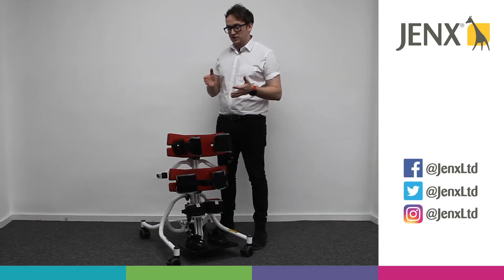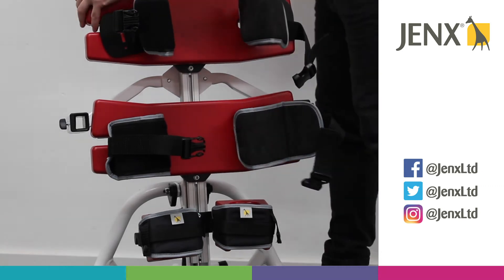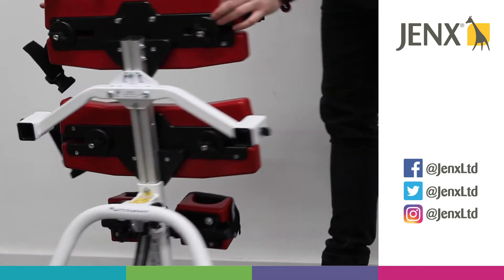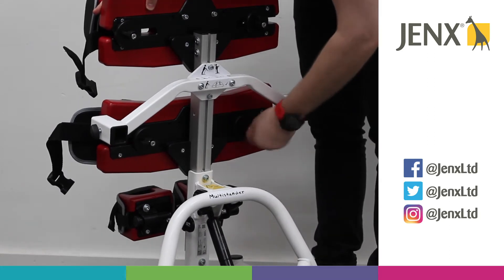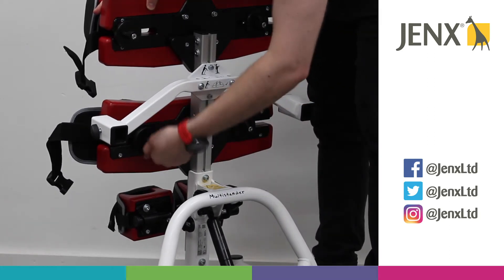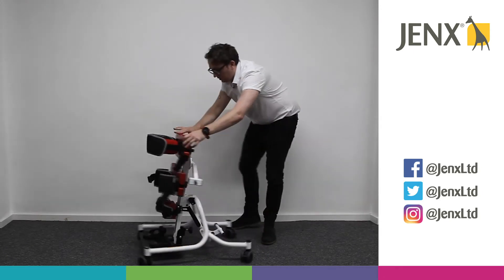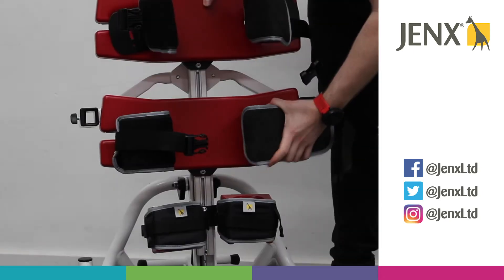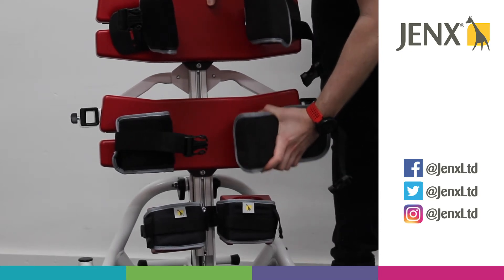If we are looking to adjust the hip supports, we just unclip the safety strap and turn the stander around. We have got two wing knobs for each support. We can loosen those off, and now we're able to position the hip guide and the hip support wherever we want.